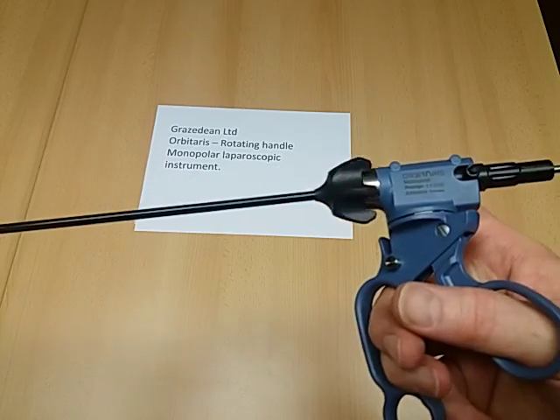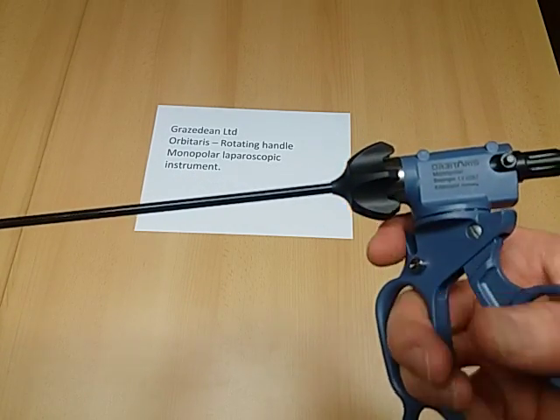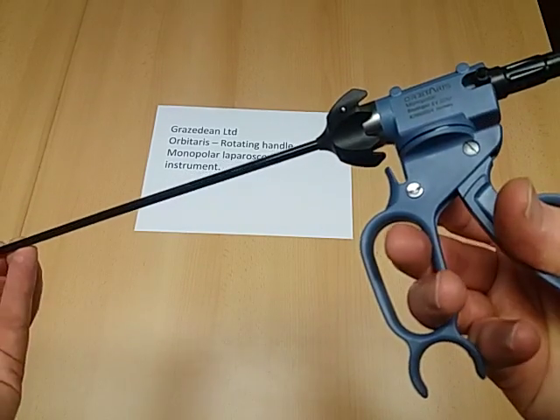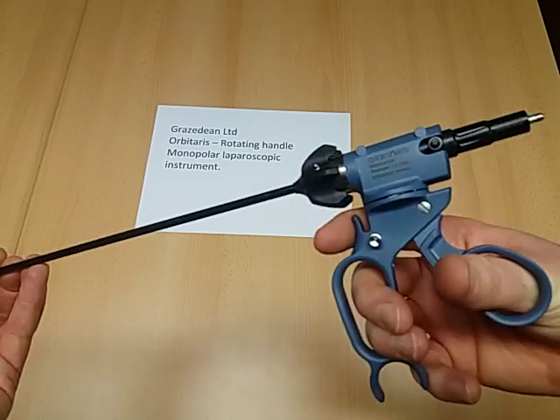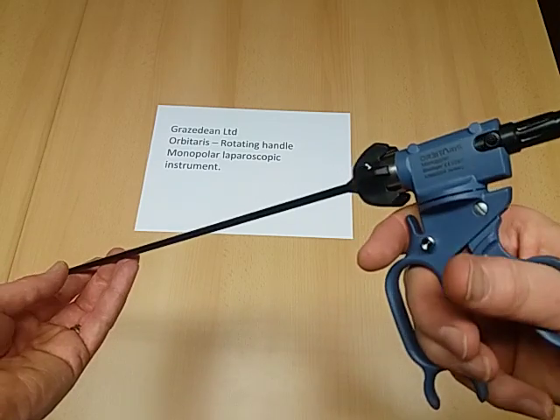The long extended flutes on the shaft allow for full rotation no matter what position the handle is in relative to the shaft. If the surgeon prefers, he can of course use the device in the standard position.